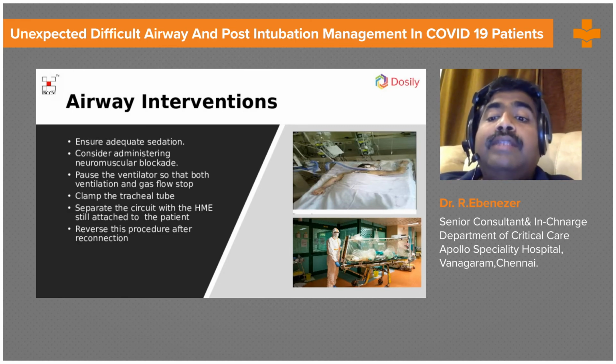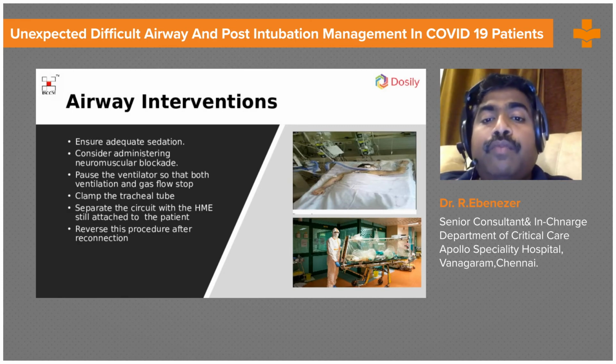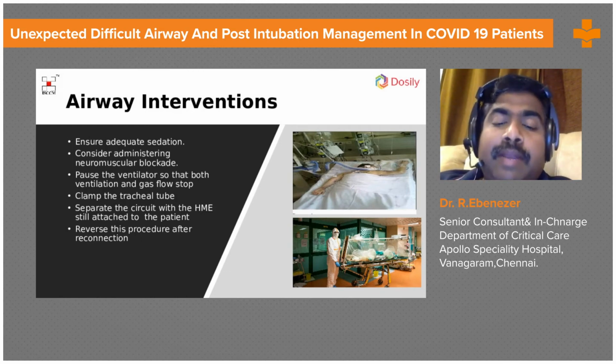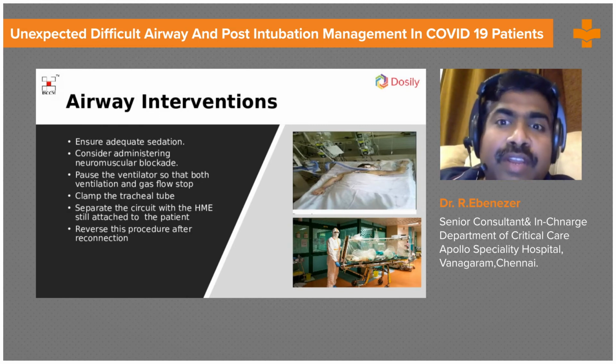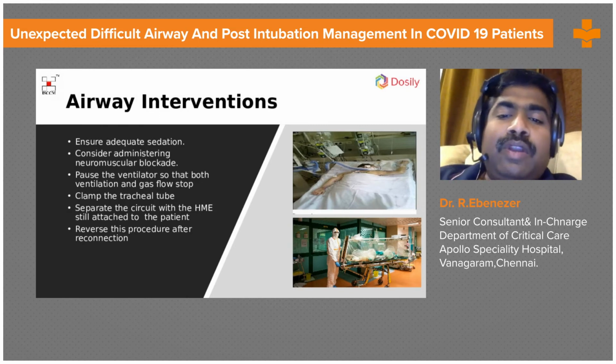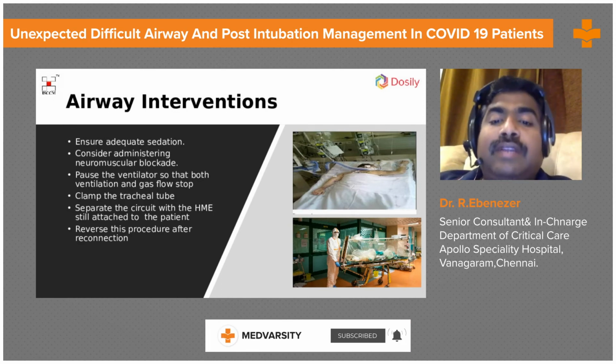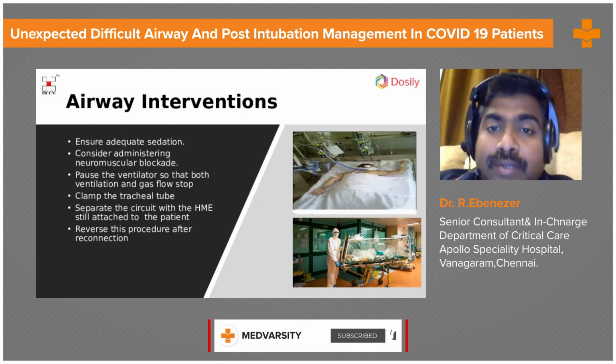When you're transiting them down for a CT scan, better not to ventilate them by hand. Have a portable ventilator in place so that you are not very close, and you're not in a position where you're ventilating with the circuit near your face. That's what I want you to understand. These are things which you should remember.